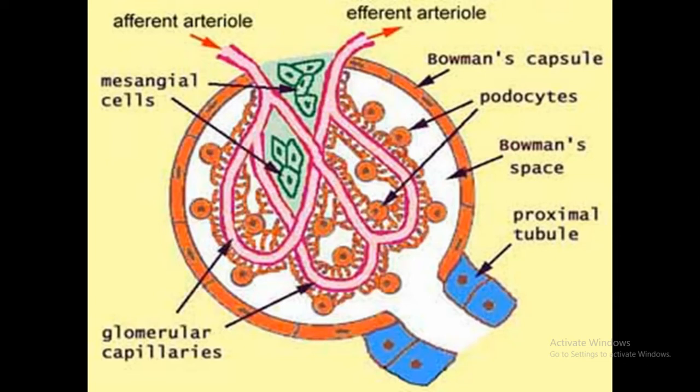The other important special stain is silver stain, with which I can see sclerosis. Then we have, for example, the trichrome stain, where we can see the collagen deposition, and the Congo red stain which is specific for amyloid.